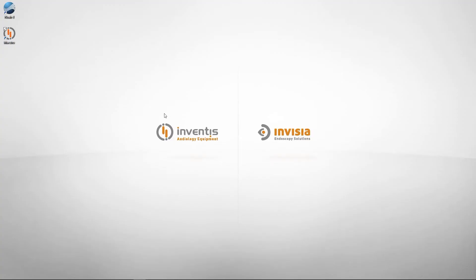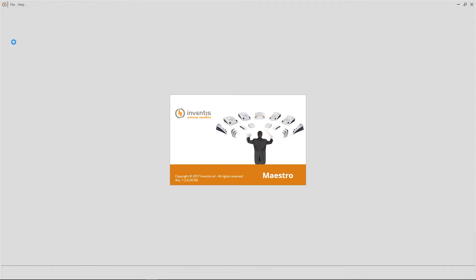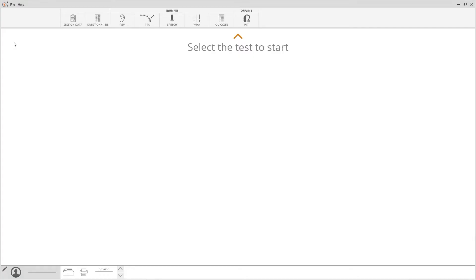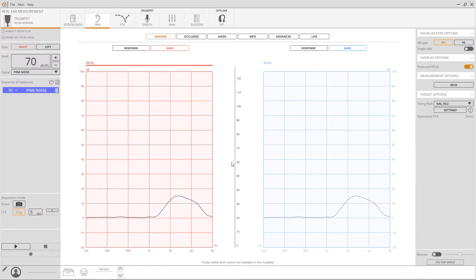To start, double-click on the Maestro icon and the software will open. Exams available will be shown on the upper part of the software. Select REM to access the in vivo tests and then choose occluded.